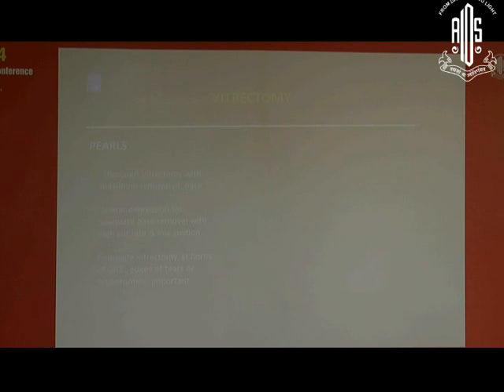So this was actually operated bimanually to have a better view of the video, and sometimes you can do cryo also at the edge if you are having a very anterior GRT where you need to localize the flap.